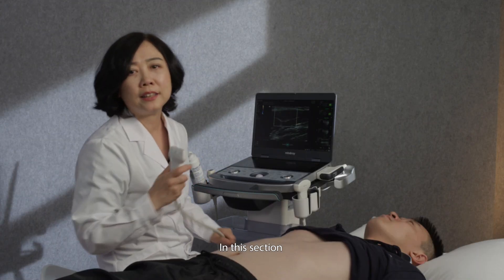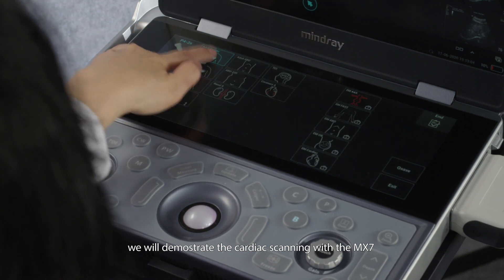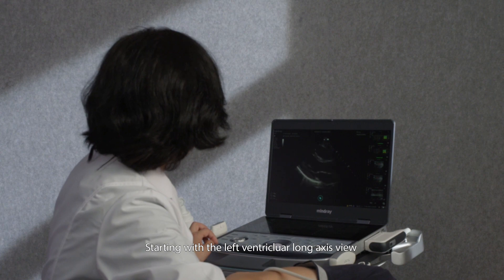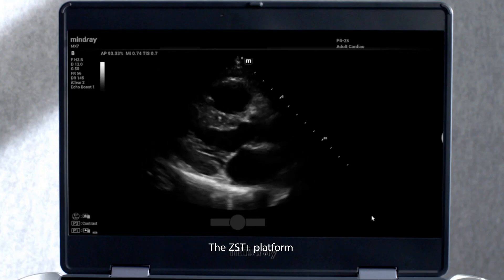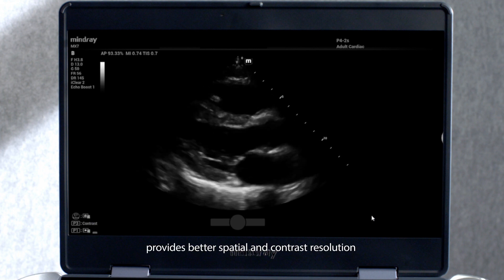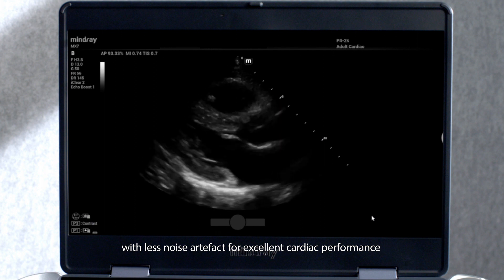In this section, we will demonstrate cardiac scanning with the MX-7, starting with the left ventricular long axis view. The ZST Plus platform provides better spatial and contrast resolution with less noise artefact for excellent cardiac performance.